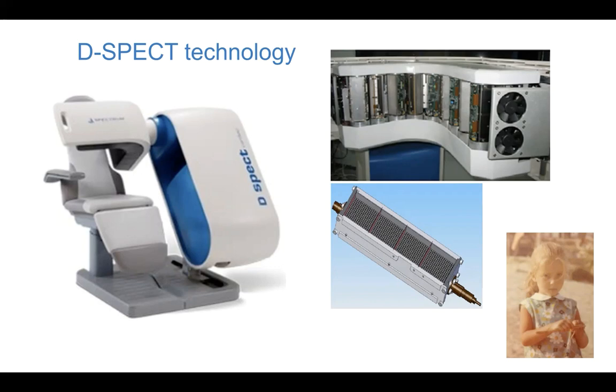In order to obtain the best reconstruction of your images, a specific reconstruction algorithm that models this particular geometry has been implemented and allows for an improvement in spatial resolution and image contrast. But you can find all this information very well detailed in previously published papers.